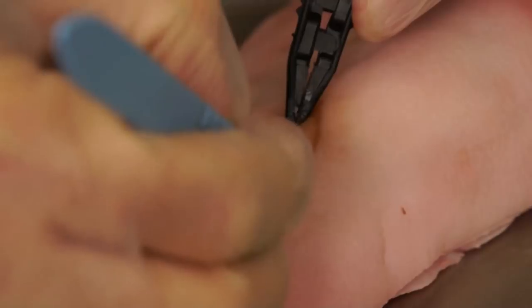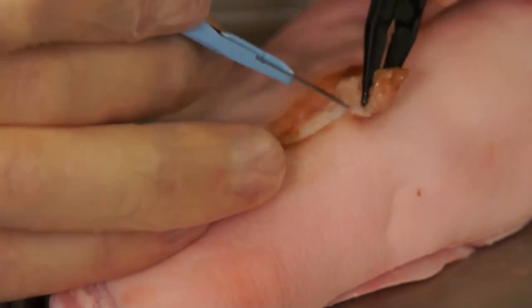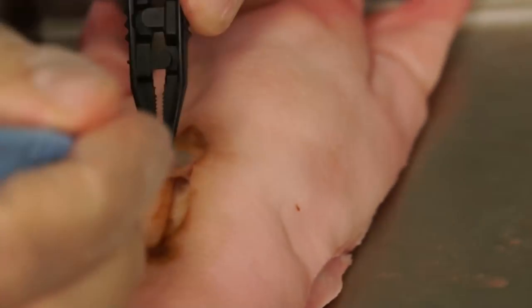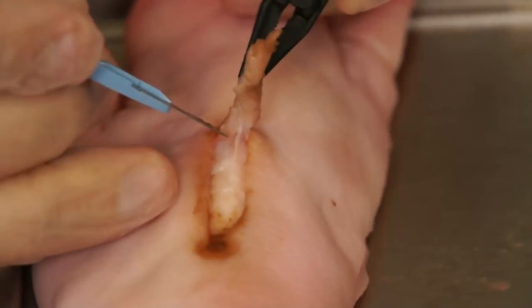As you can see in this demonstration, this plane is being developed and the demonstrator is working around three edges of the eschar, maintaining the interface between the healthy tissue and the dead necrotic tissue while maintaining tension with the forceps.